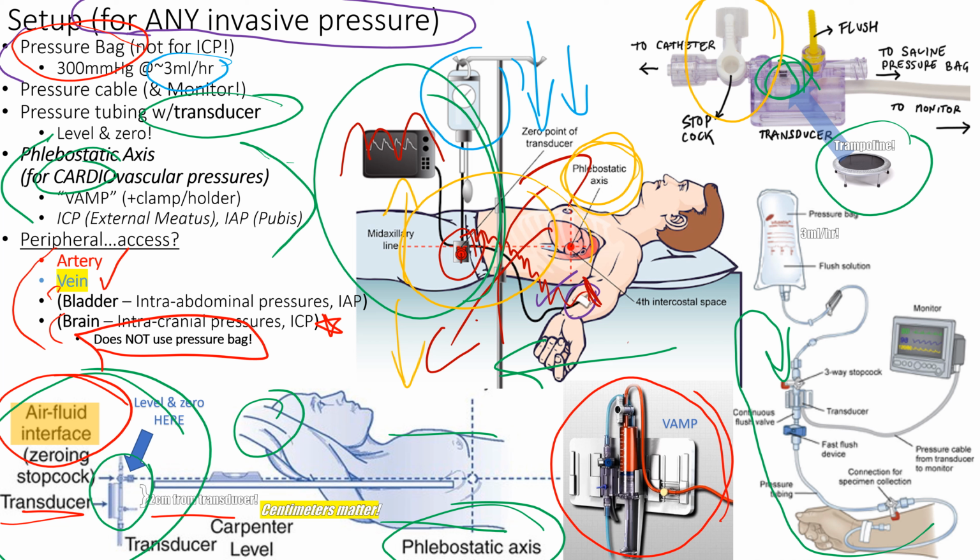Usually, if you look at the tab and you feel it, it says "off" in Braille, right? So you can see on there it says off, and everything else is usually off as well, except for one little tiny exception. Usually it's on the vamp right here. But otherwise, that lets you know where flow is going and what's going to happen if I open this or don't open it, right? Because sometimes you want to have it open to air. So if I want this trampoline open to air, I got to turn it off to here. That way it can see air, right? So it can feel the cool or warm Antelope Valley breeze.